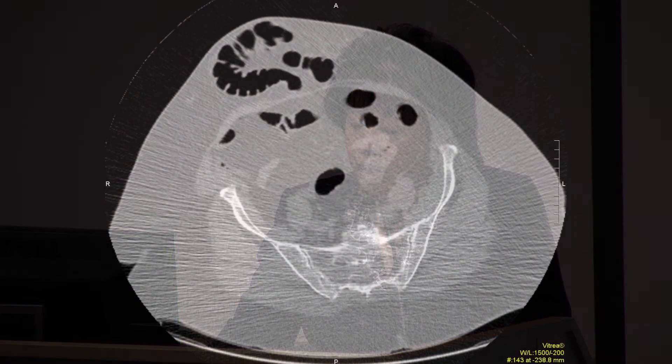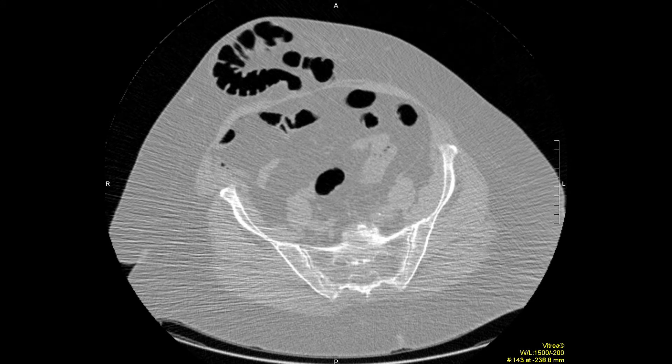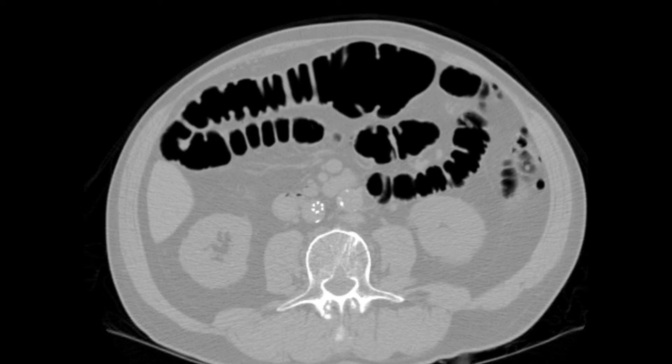Some of the first patients that a lot of sites will get are failed colonoscopies. This was one of our earlier patients who had a large ventral hernia — they had no idea. The colonoscopist simply could not get the scope to reach the cecum. With the CO2 insufflator, we were able to easily distend the entire colon and to clear this patient.